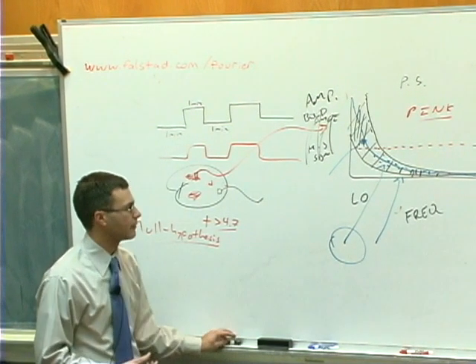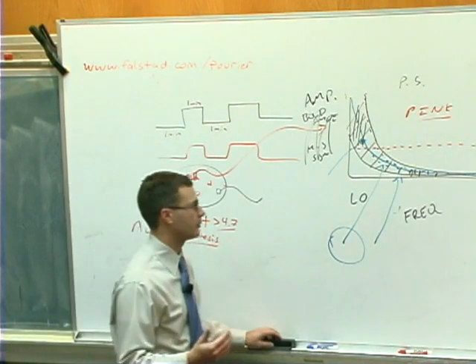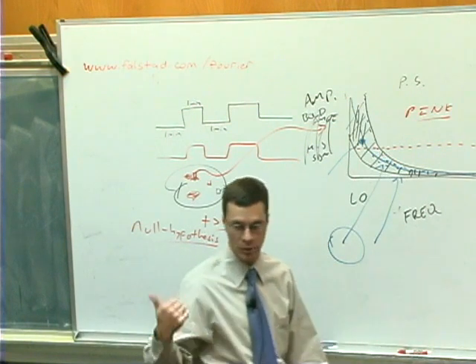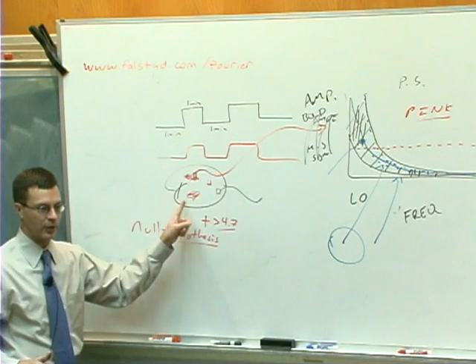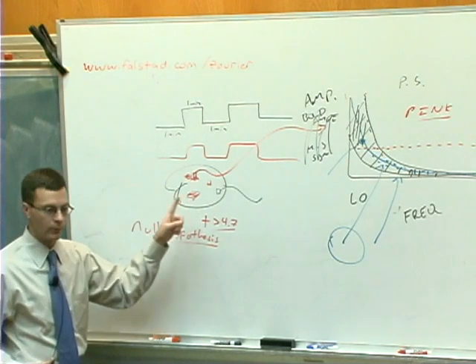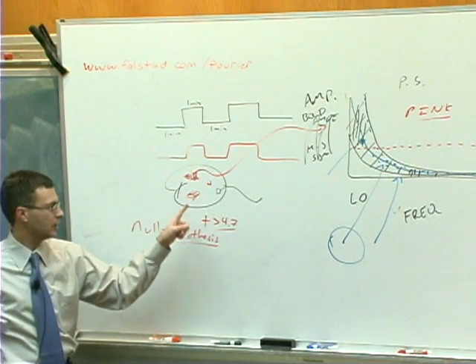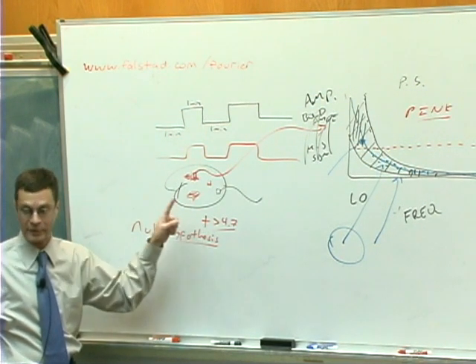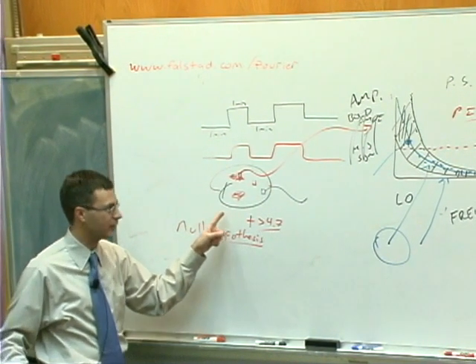So, 1 over f noise, this fundamental problem. What are some consequences of 1 over f noise? Well, number one, we know traditional parametric and non-parametric statistics are no good, because they give you results like this. Even if the subject did nothing in the scanner, and you assumed that they did some kind of low frequency task, you will find something in the brain somewhere that correlates with the task that they didn't do, which obviously is not a property you want of a statistical test.